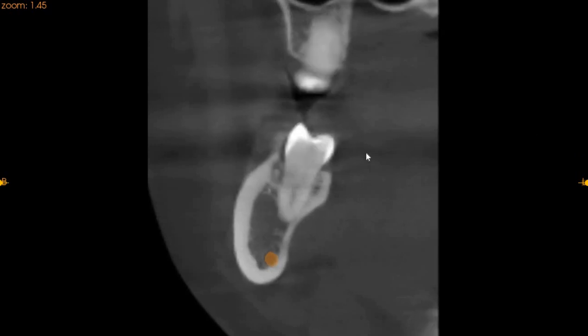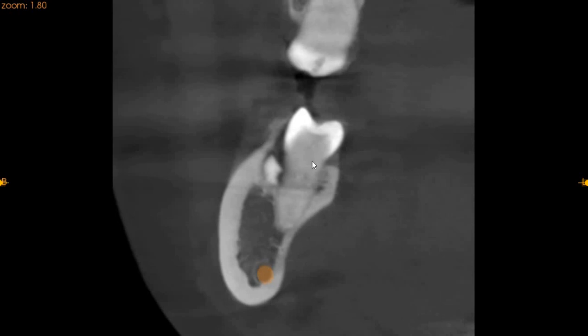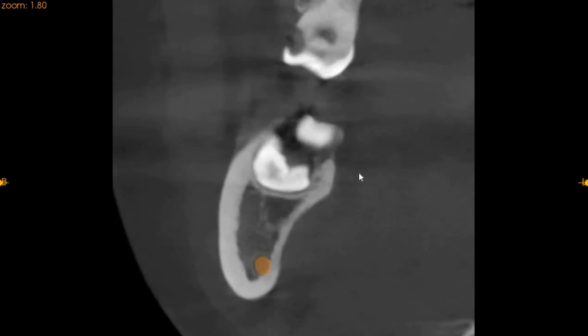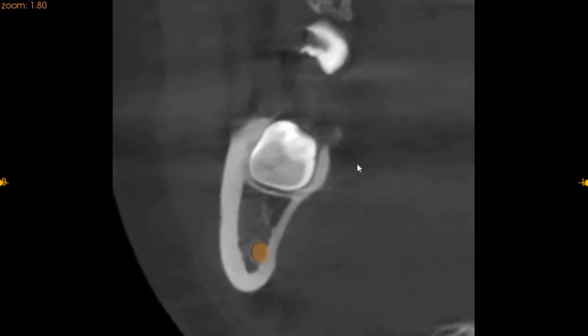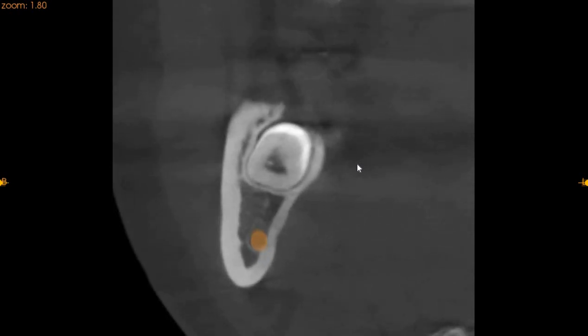As we're moving distally, here you can see that the wisdom tooth starts to appear. The wisdom tooth is closely associated and the mesial cusps of the wisdom tooth are engaged with the second molar. You can see the crown of the wisdom tooth and the pulp chamber. As we're moving towards the roots, the orange dot is the inferior alveolar nerve and it is very extremely closely associated with the wisdom tooth.